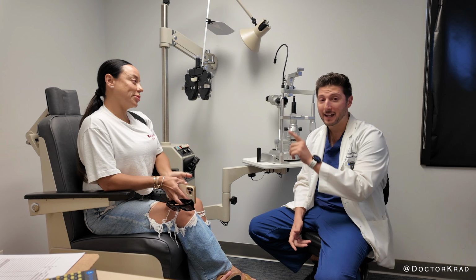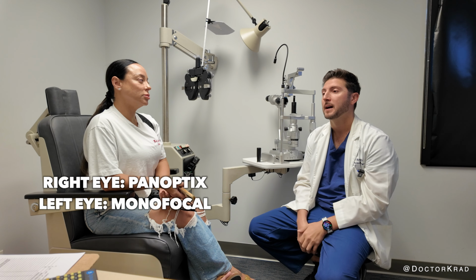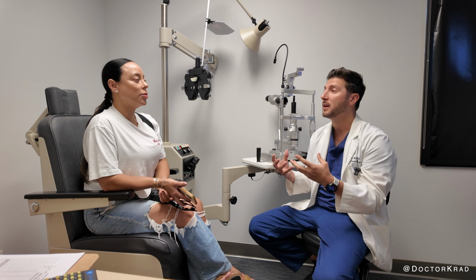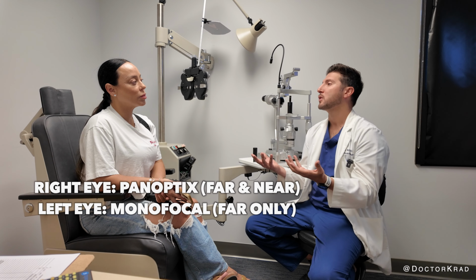Okay. So that eye, her right eye, has a Panoptix, but it's centered well. And she was doing well with her right eye. And so now we're going to see if the eyes work well together. We're going to give it some time to heal. But how are your eyes working together so far?